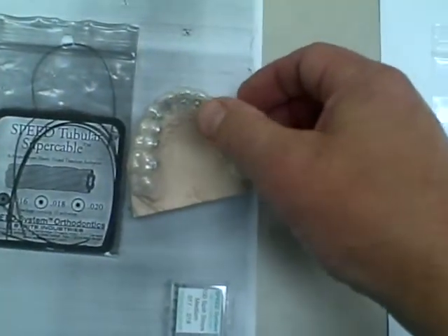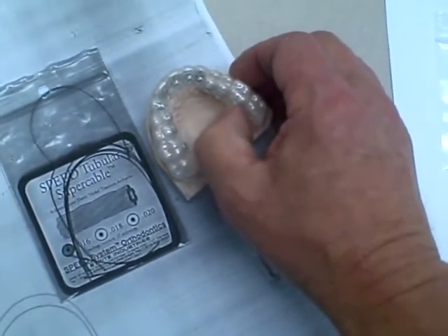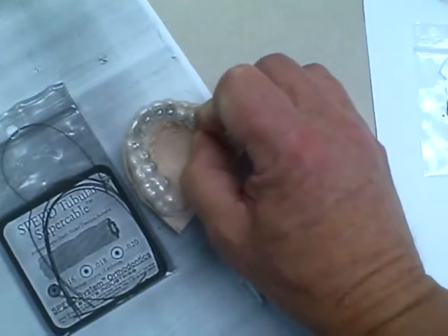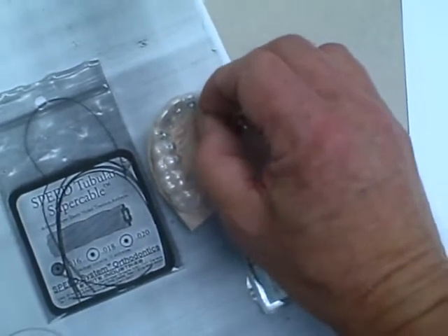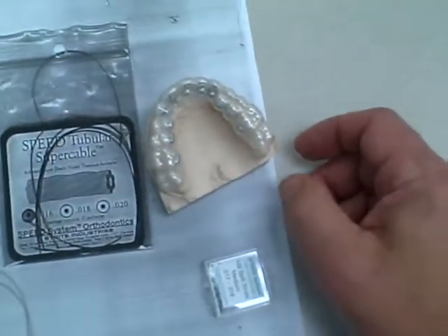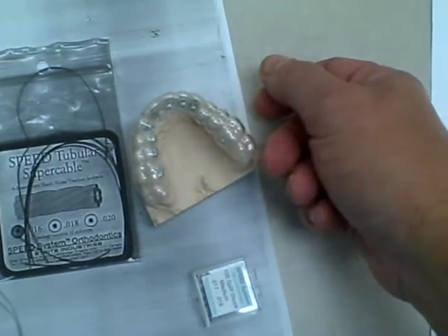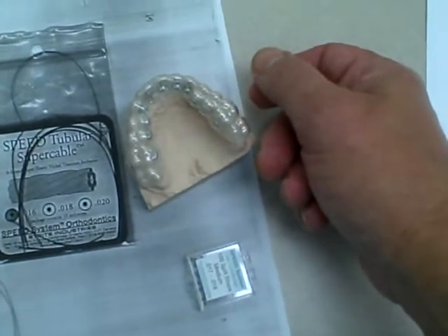occlusal, snap it into place, and then before you start to cure, I put my curing light on the lingual of the bracket that I'm going to cure, and I push just a little bit while I keep downward pressure on the occlusal surface. Then I go to the next one and cure. Same thing. I'll cure with the outer tray on, 10 seconds per side of the tooth. Then I'll peel the outer tray, and with the soft tray on, I'm then going to cure another 10 seconds, especially from the gingival margin.